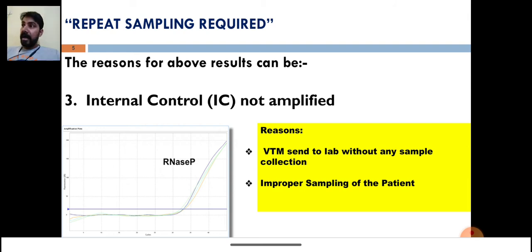If the sample is not collected properly, it can be a reason that IC will not be amplified in RT-PCR, and the lab has to report the sample as repeat sampling required.